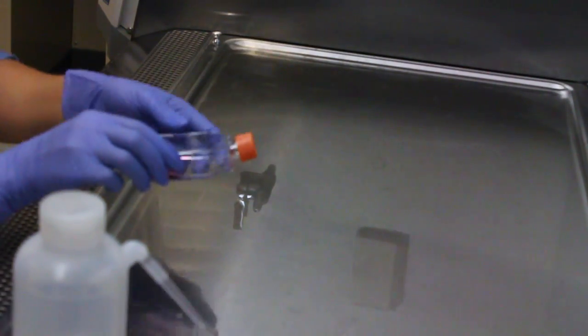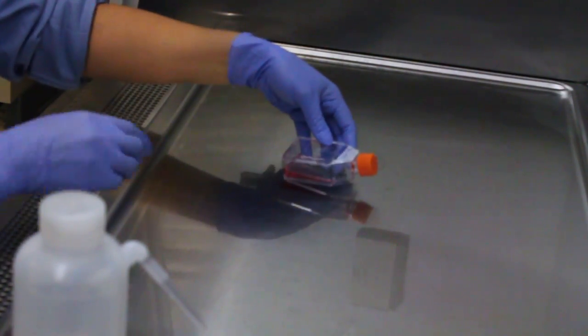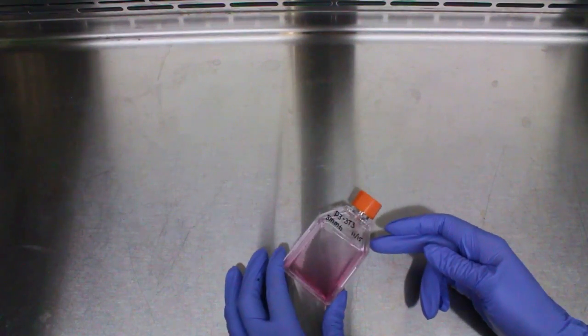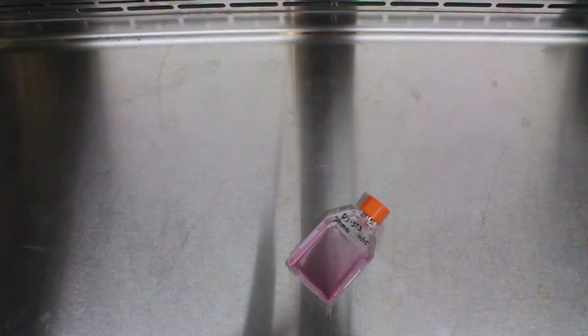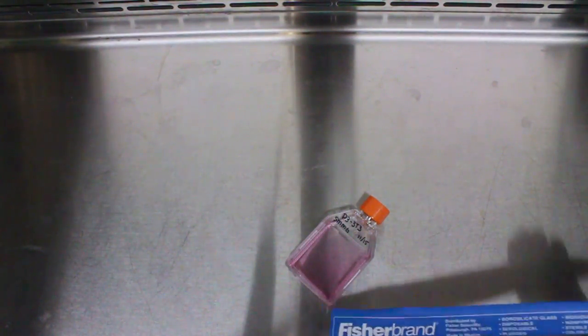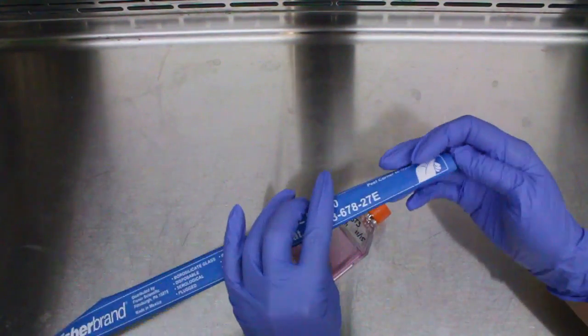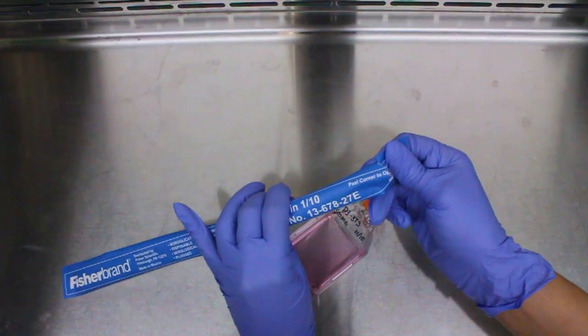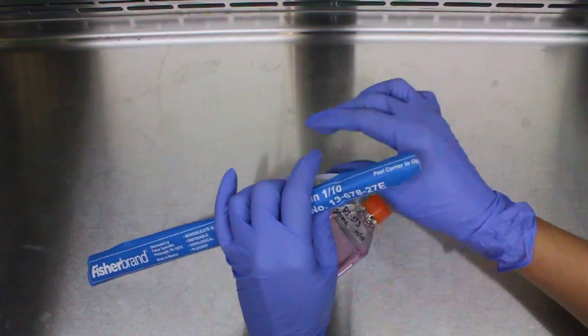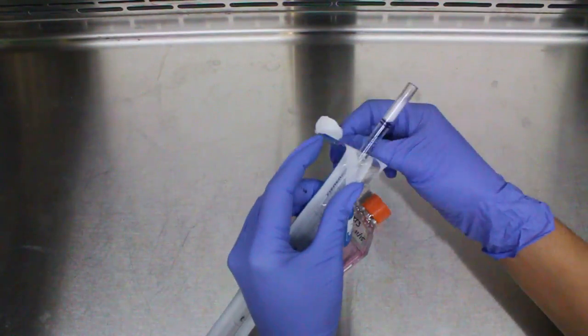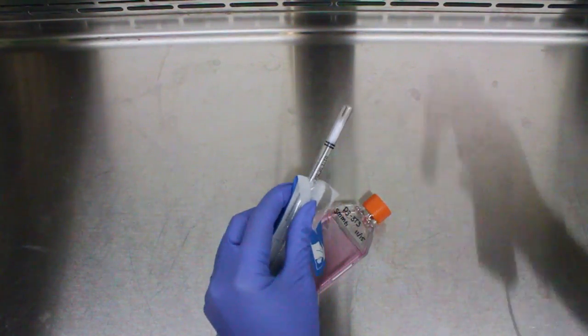Now bring in your cells that you just removed from the incubator. Open a sterile serological pipette by peeling back the paper like you would a banana. Be sure not to touch any part of the pipette.